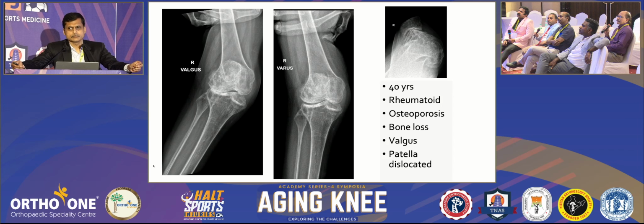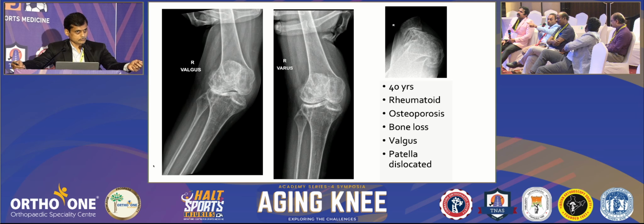Anup? Yes. In this kind of valgus knee, always document the foot deformities, especially as MCL insufficiency will be there. If the patient has a pronation type of foot deformity, they could present with late instability, so always support post-surgery. That is one point I would like to add. It is a regular medial parapatellar approach, as Dr. Rexa said, with standard Ranawat inside-out release, PS knee. I would like to resurface the patella in this case because maltracking is there. That will be helpful to give good tracking post-op.